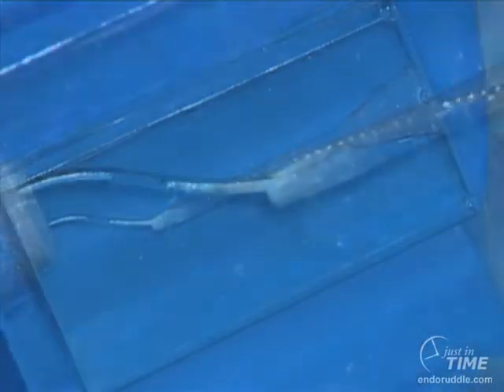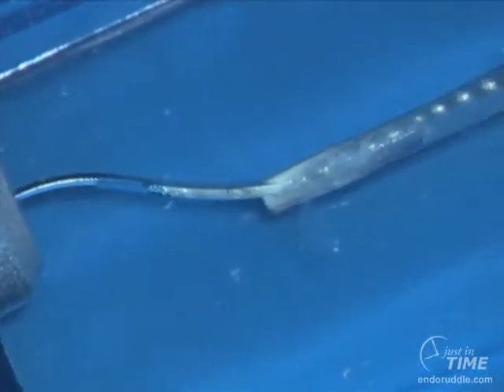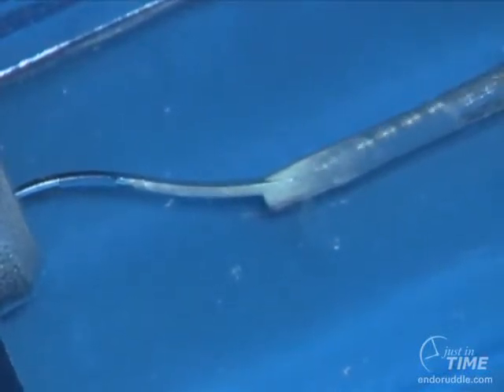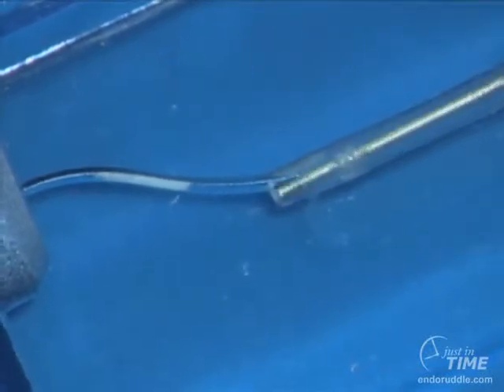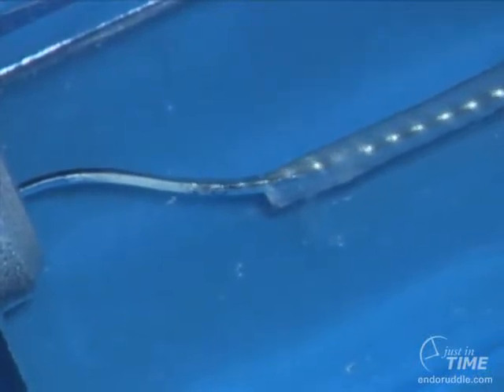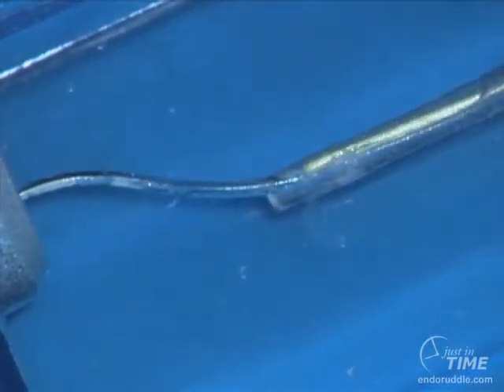In other instances, when the ledge is fairly significant, we'll determine that there's a ledge clinically, but we may not be able to eliminate that ledge following negotiation and shaping procedures. So I'd like to talk to you about canal preparation in the instances where we do not have a smooth, reproducible glide path. I would recommend that the colleague go back and look at the other shows that I've previously done on canal shaping and what we do to get a regular glide path and what we do when there's an irregular glide path. We're focusing now on negotiating apical to this large ledge.